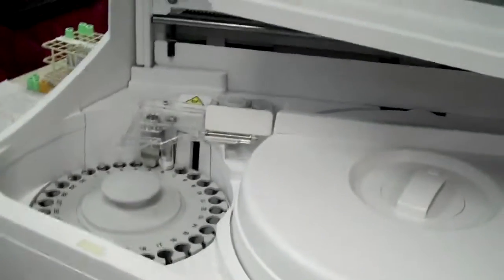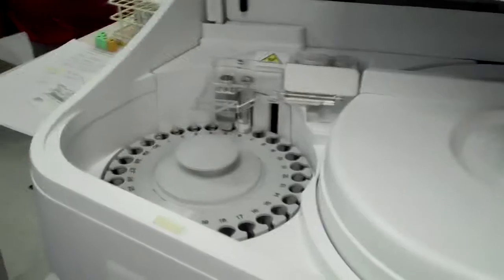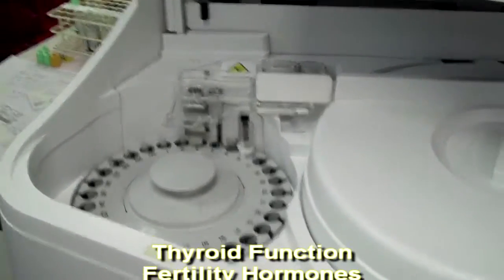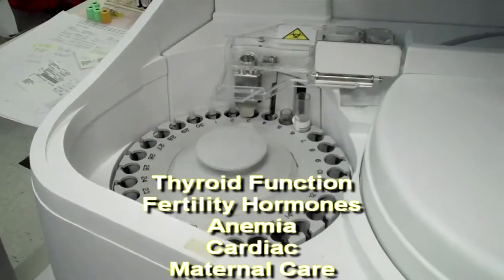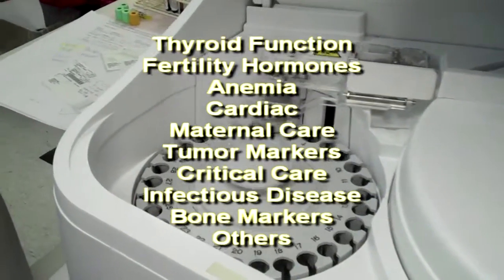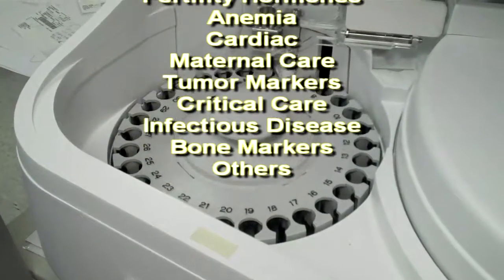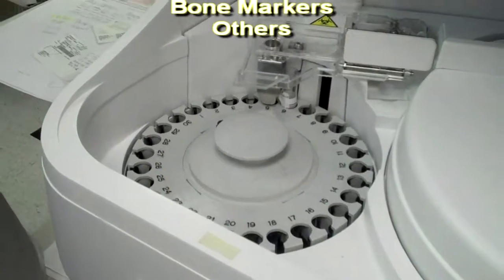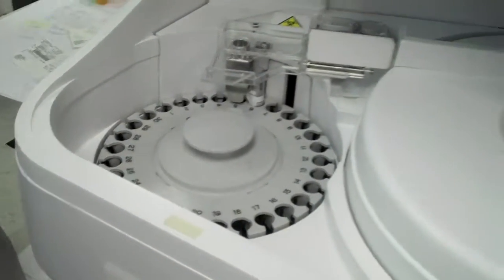This one does troponin and CKMB, which are cardiac markers for heart attack diagnoses in the ER. It also does the quantitative HCGs, which is a pregnancy marker that gives you an actual number. Quantitative usually means a number. Qualitative is just going to mean positive or negative. So this is a quantitative HCG.